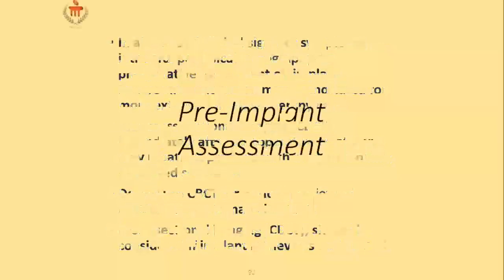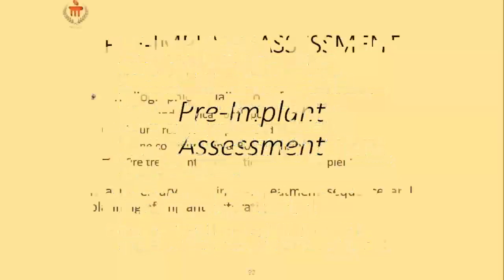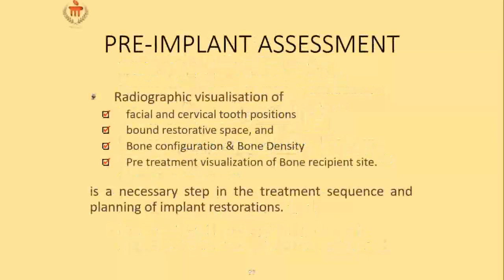Okay, fine. Then, what are the steps? The first step is looking at the facial and cervical tooth position, looking at the space around, and mainly the bone configuration and density. Everybody talks about, is this bone quality good? That's what we need to discuss.